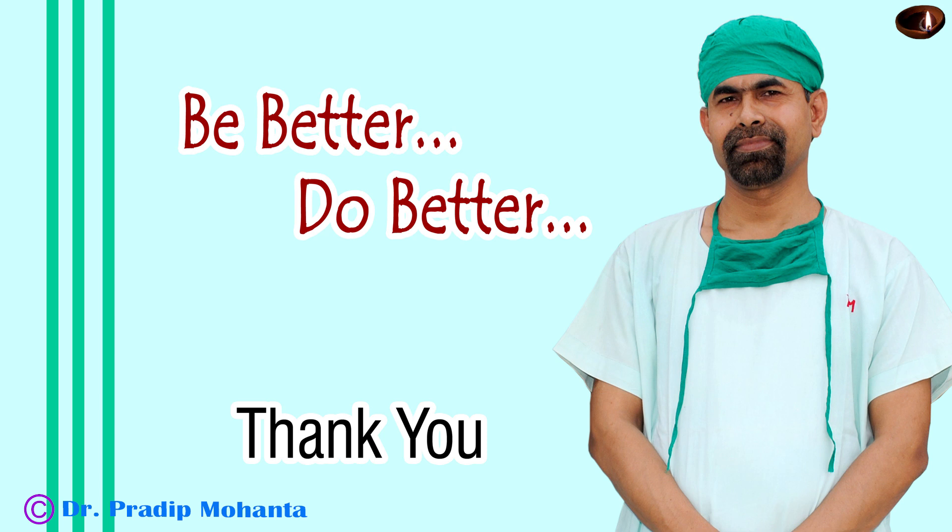Hope this video will help you in developing your surgical skills. Do single-handed phaco in IFIS. Divide the nucleus into small fragments — about 6 to 8 fragments — and emulsify the pieces single-handedly. Don't use the chopper and you will be amazed how easily you can do that. Thank you.